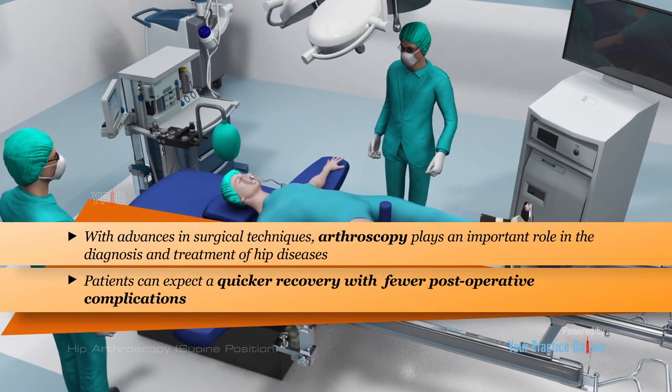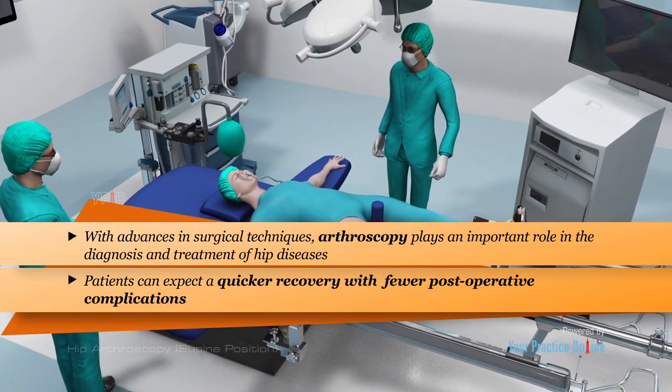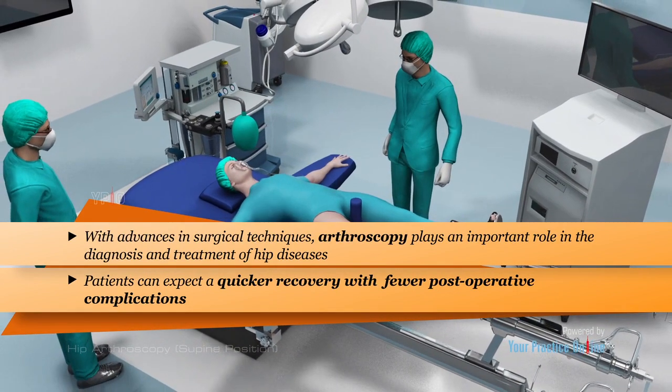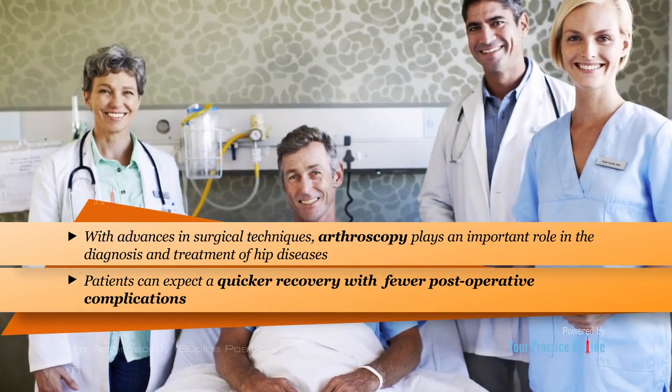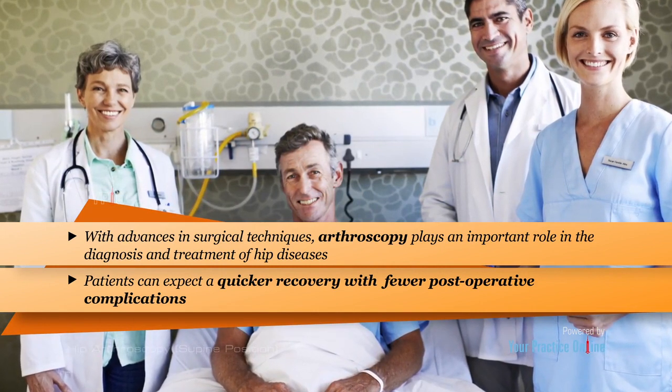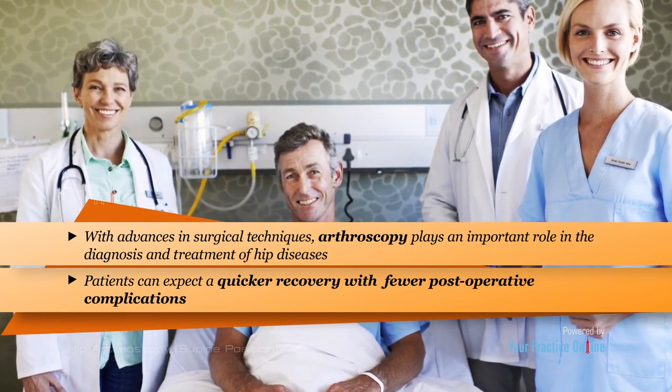With advances in surgical techniques, arthroscopy plays an important role in the diagnosis and treatment of hip diseases. Patients can expect a quicker recovery with fewer postoperative complications following hip arthroscopy when compared to open surgery.